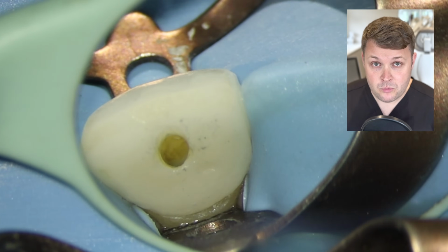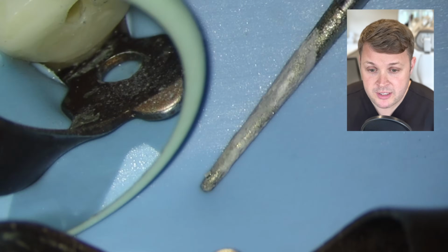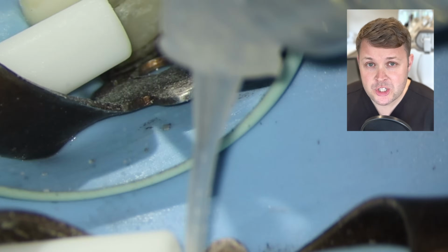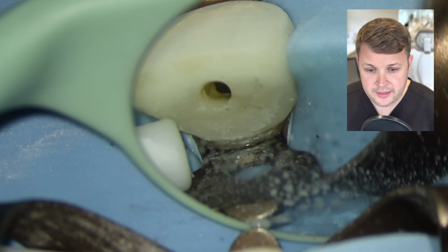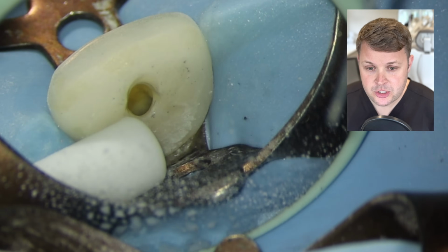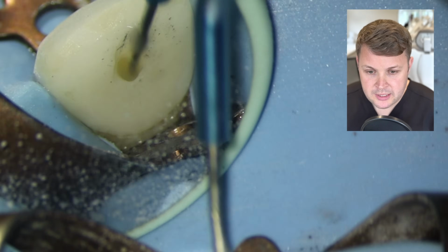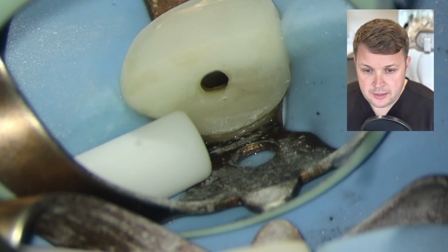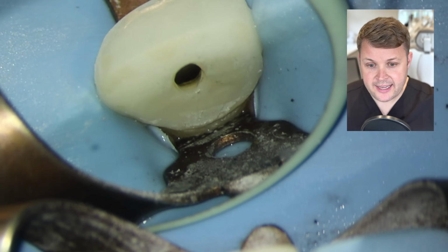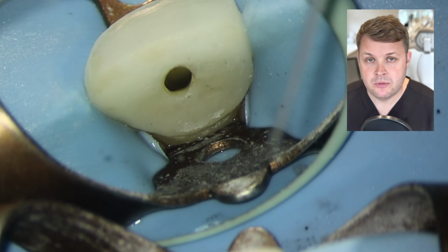But one of the non-negotiables about accessing an anterior tooth is removing that lingual shelf. It's kind of like a hump, which makes it really difficult to obturate the tooth with this hump in situ. So I've removed a little bit of the lingual shelf here, but I just need a little bit more removal. As we remove it and irrigate, again it looks a bit better, but there's that kind of hump here, which still just needs to be removed.